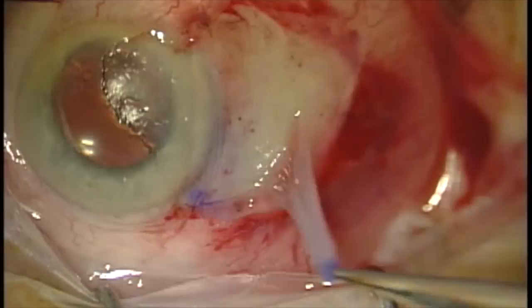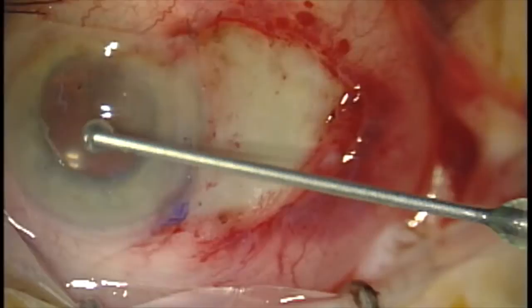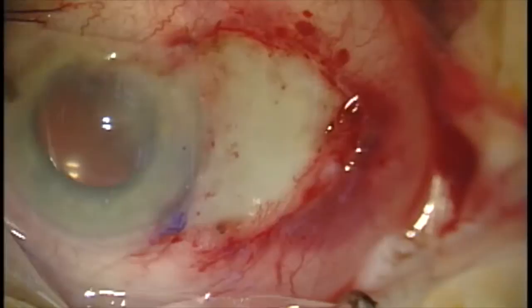Once we have those two anchoring sutures in place, we go ahead and flip the graft over onto the corneal surface and apply tisseal tissue glue in the bed of the excision. I like to put one component on the underside of the graft and then place the other component in the bare scleral bed.